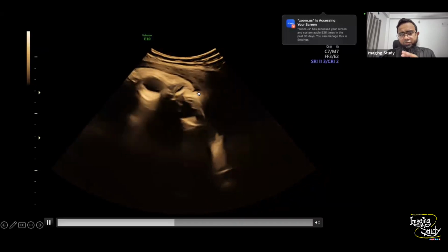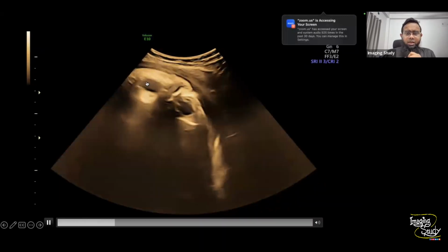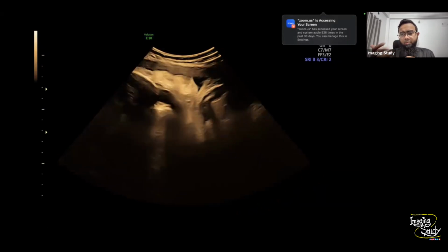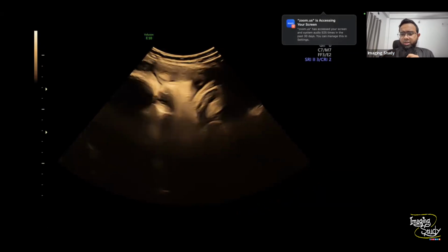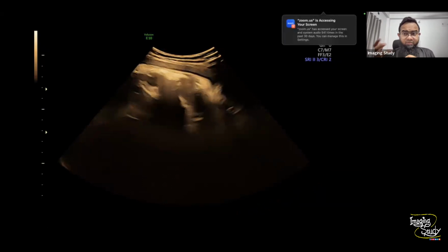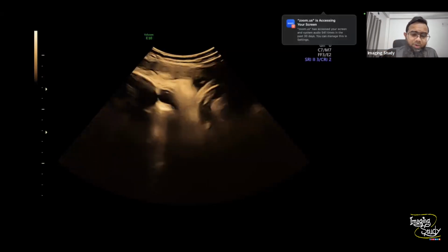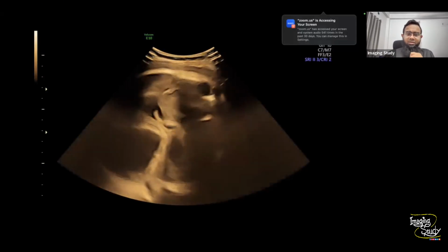Okay, so here's the face region. I searched for facial abnormality. There was no facial abnormality. Orbits look quite normal. And now the question is, is this situation making any bad prognostic condition for the patient? So you definitely should evaluate the renal system, and the cardiac evaluation is also recommended, because that will help you understand the situation of this patient. So we went for the cardiac evaluation also, so we'll show you that.